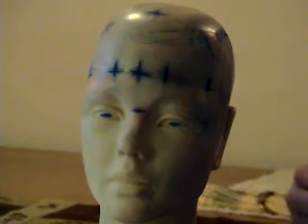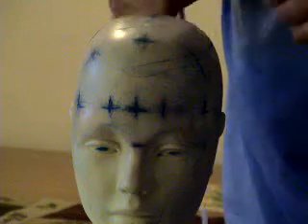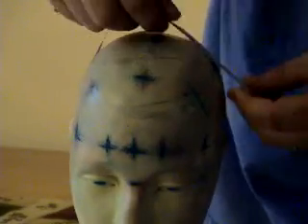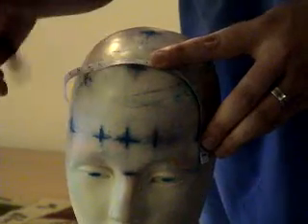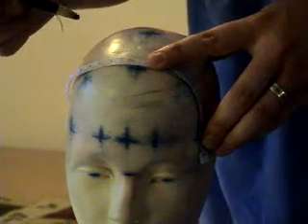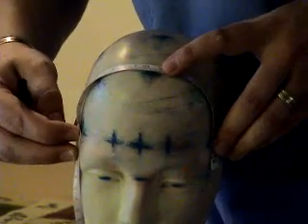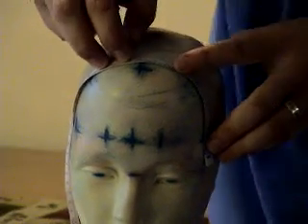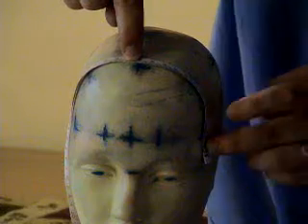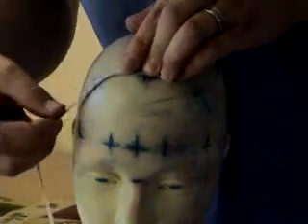The next step, you can start at the front or the back. It doesn't really matter which part you start at, as long as you get them both done. Now at your cross point here, you're going to place the tape, making sure to pass through this line right up here, which will become FZ, and all the way around to the other side. And our measurement is 20 centimeters, half of which is 10. And then between these 2 points right here, half of 10 is 5. Do the same on the other side.